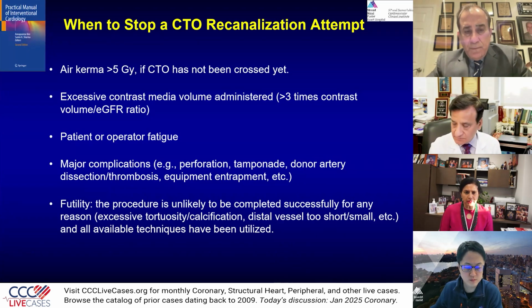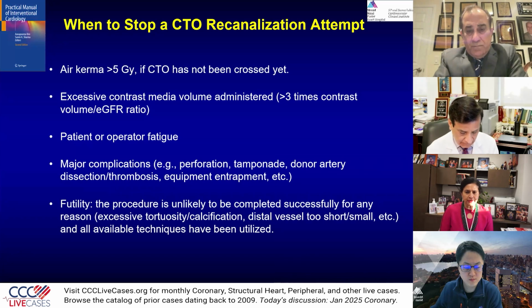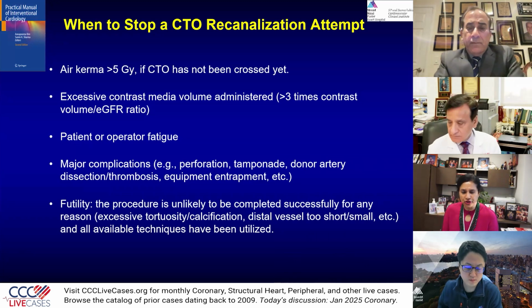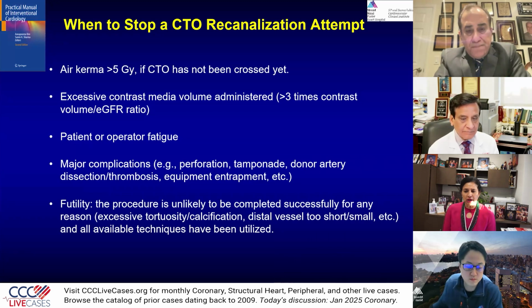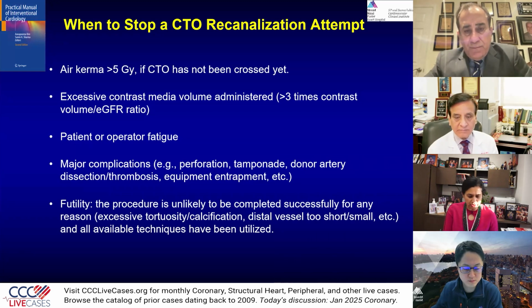The question is the same. I think when you do these complex procedures, it's important that things go smoothly and at the right time, in a quick fashion. So our air kerma was just about 4.4, and the contrast was about 220 or so. So everything met the guideline-directed CTO recanalization. The patient was a little bit uncooperative, if you can see, but operator fatigue definitely did not happen. And at the end, we've shown no major complication. So this is where we are: we were able to get this procedure successfully done.